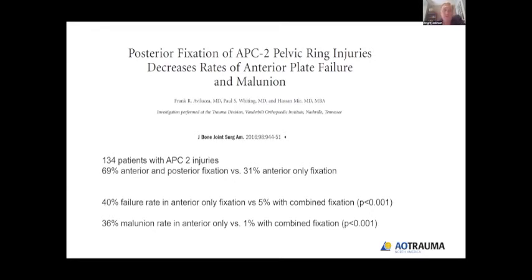And just a quick word on anterior plating. Usually that superior plate is enough. There's a history of double plating symphysis, and in my experience, the bone from the front to back for that anterior plate is pretty unsatisfying. And in my opinion, a single plate with posterior fixation is the optimal fixation construct for most things. And certainly 2 plates and no posterior fixation doesn't add enough to really be a worthwhile endeavor.